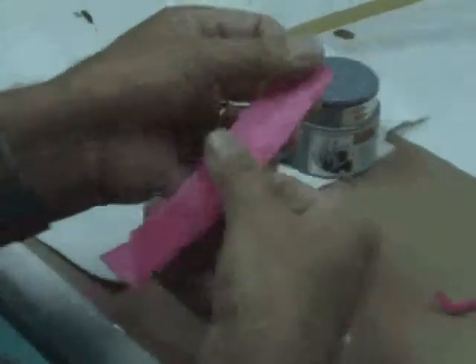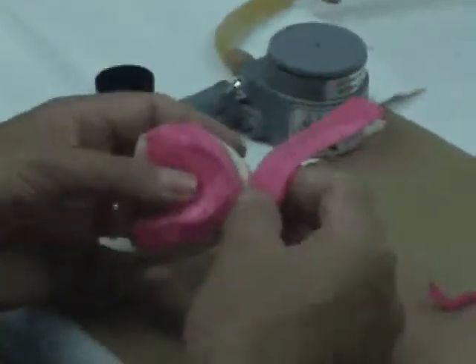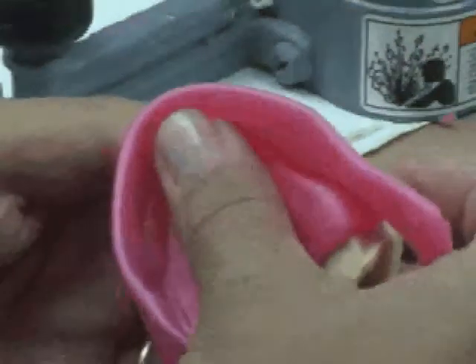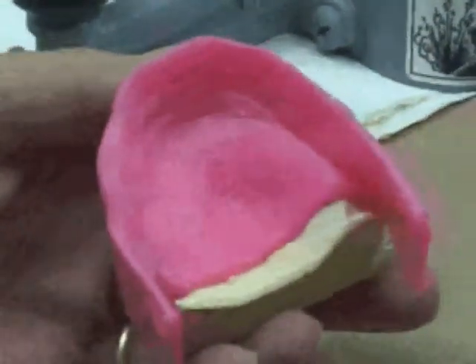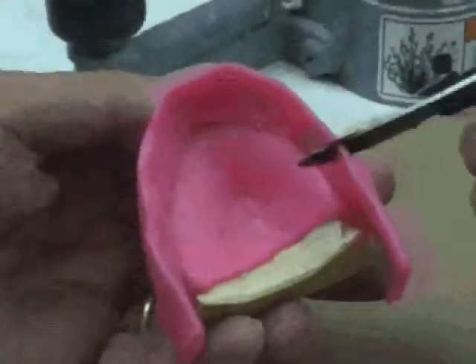Takes 2 sheets of wax to make an aesthetic control base for the maxilla. Then we just place it into the buccal fold, mucobuccal fold, and just start molding the wax in and shaping it. And then we're going to cut it off, cut the tail, the back end off with the waxing knife.